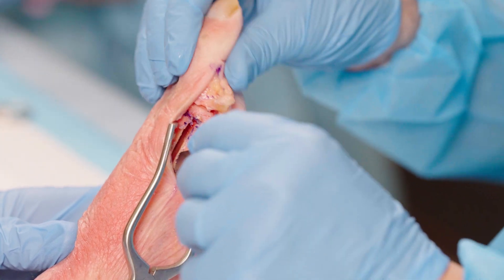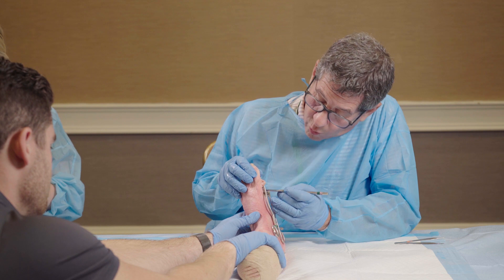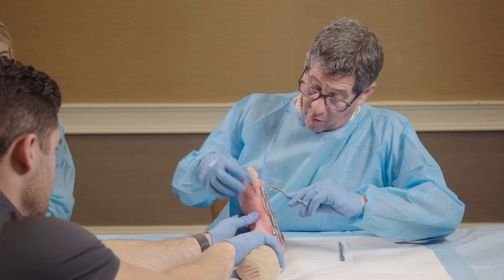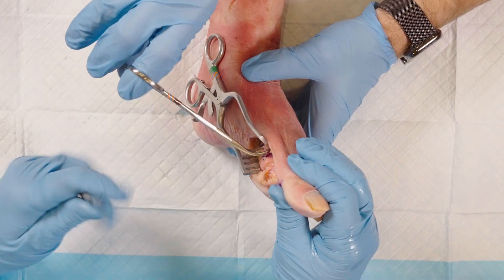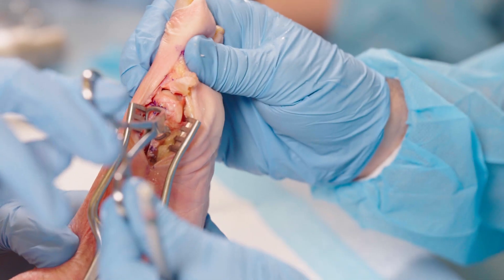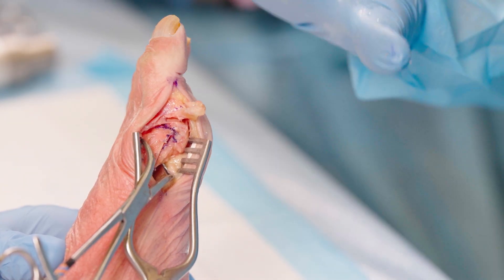You can see I'm just going to put the blade in — we've made the cut back here, here, and here. Now we have a nice mobile capital fragment. Once we have the metatarsal mobile — we didn't really have deformity in this cadaver specimen — what I would normally do is take a small retention device. I would have somebody pull out on the proximal aspect and I'd be moving the capital fragment over to correct the intermetatarsal deformity. You can see this being pulled away and me pushing the capital fragment over, moving a big amount of bone. Now I've created my intermetatarsal correction and I've got a great stable osteotomy.